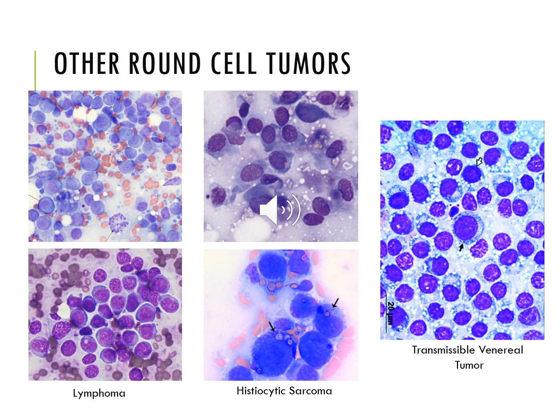The middle images here are of histiocytic sarcoma, and so these are essentially malignancies of a macrophage origin. And so these can look round to spindle in appearance, and that's not uncommon. And they behave very aggressively, especially the hemophagocytic variant. So this image at the bottom displays these red blood cells in the cytoplasm of these horrible looking histiocytes. And so this is the hemophagocytic histiocytic sarcoma, and that's just a really awful prognosis, unfortunately, for animals.